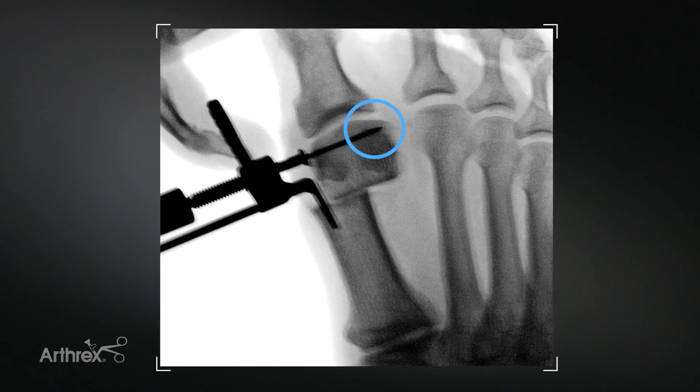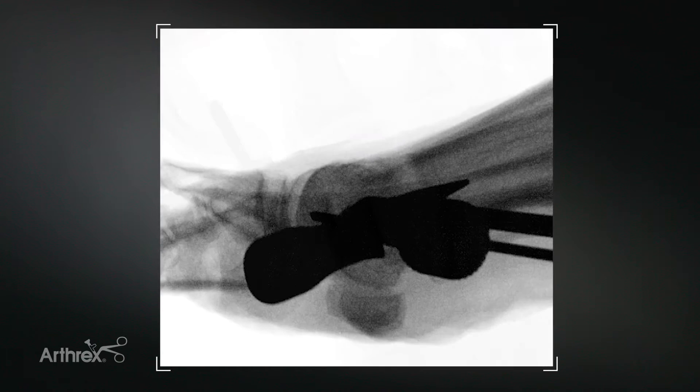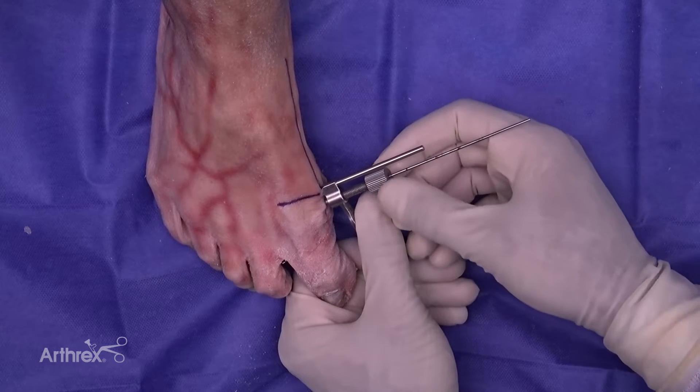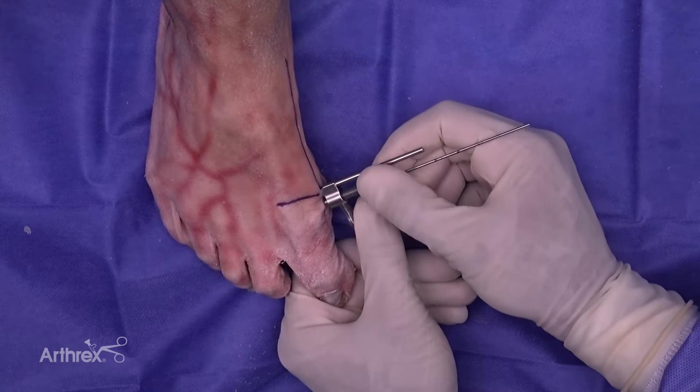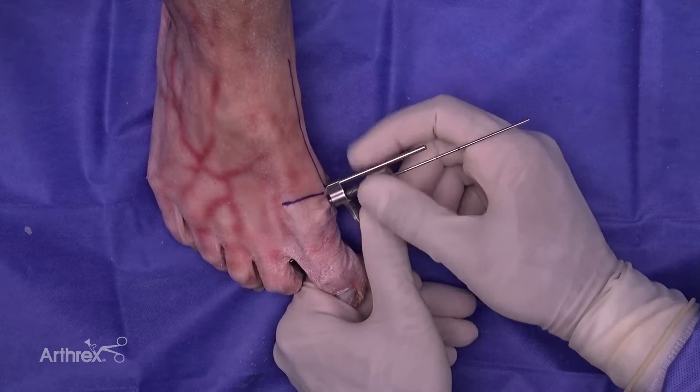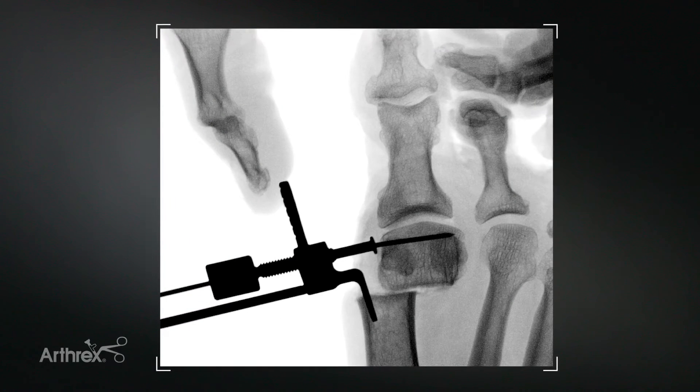You can rotate the capital fragment into correct alignment at this stage prior to obtaining purchase with the wire. On the AP view, the wire should end at the lateral cortex of the metatarsal head. On lateral view, you can see our guide is midline with the hook bisecting the long axis of the metatarsal, and this will ensure we're placing our fixation in the mid portion of the metatarsal. We're going to utilize the translating knob and turn it to achieve translation of the capital fragment. We've translated the capital fragment over 50 percent, and in this mild example, that's appropriate.